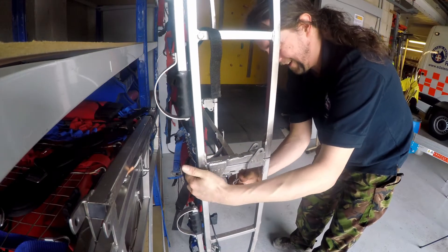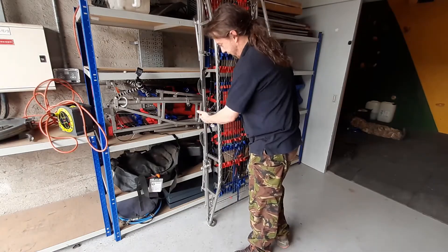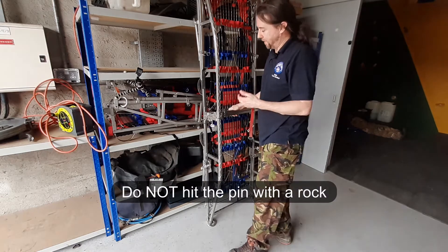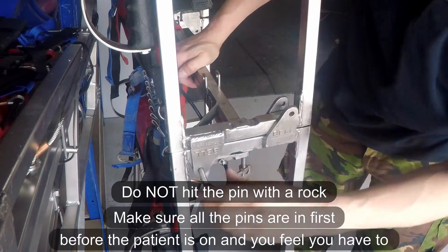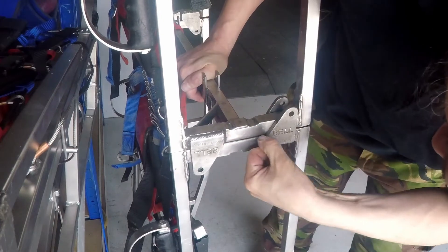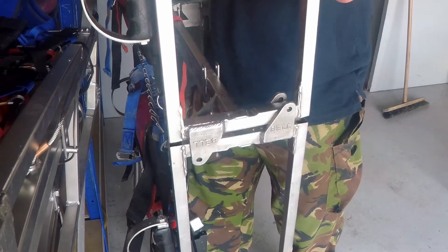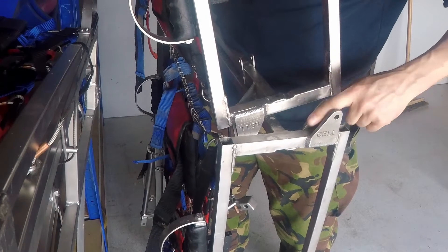You may find the pins won't go in. The general rule is: if the pin doesn't go in, do not hit it with a rock or a hammer - it probably means that something's not lined up properly. In this case, if we look here, we can see there's something stopping the stretcher from mating up properly.